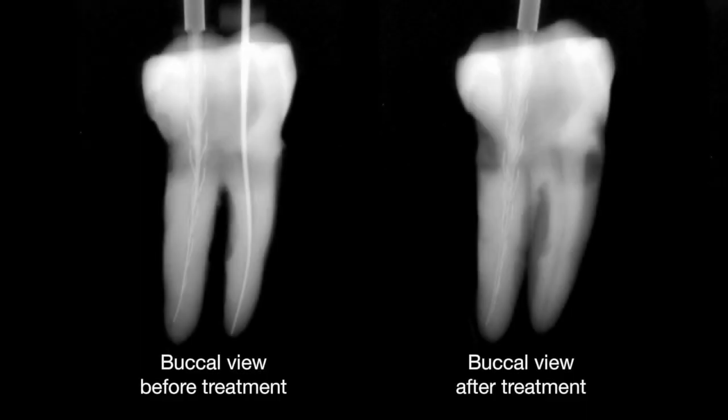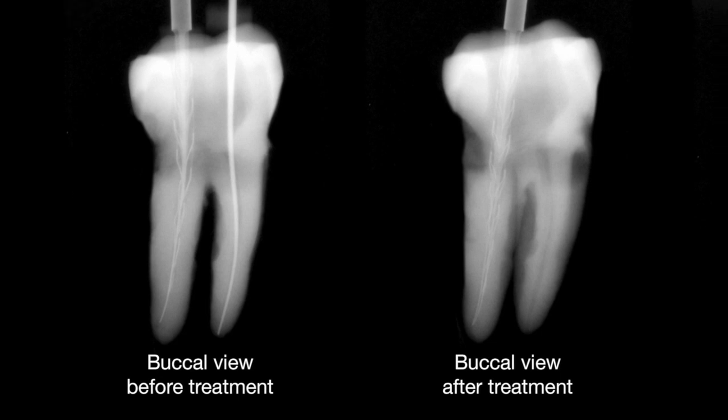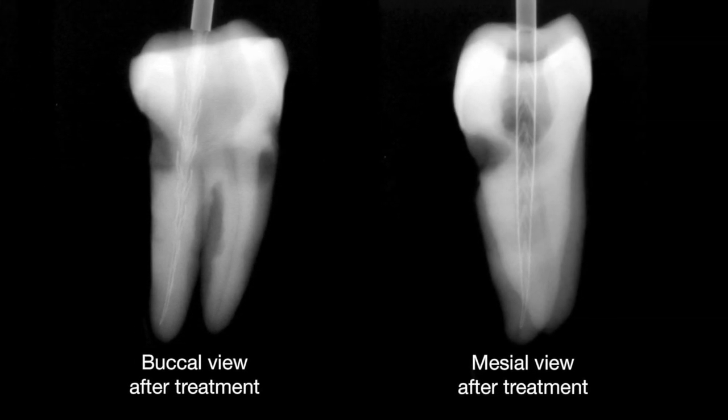The final apical dimension was gauged using a standardized gutta-percha master cone prior to obturation. With the SAF, the final canal shape remains consistent with its original anatomy.